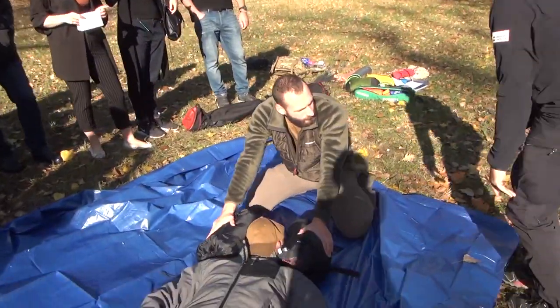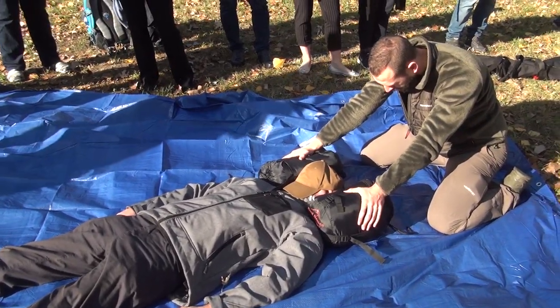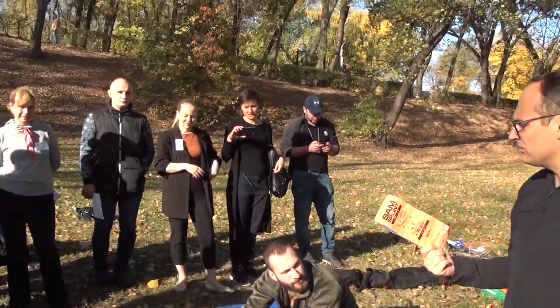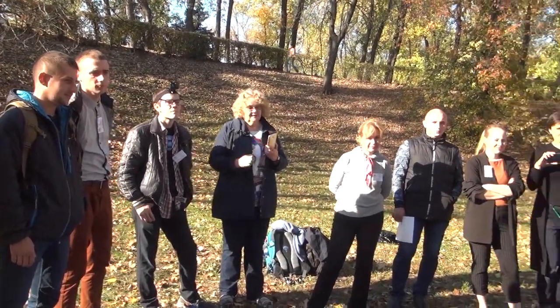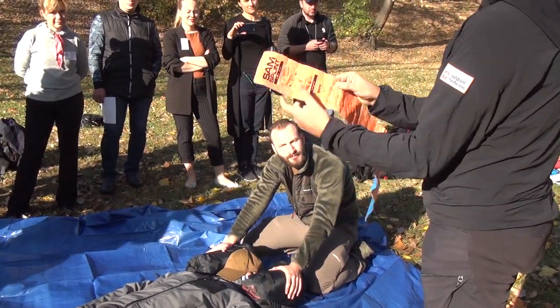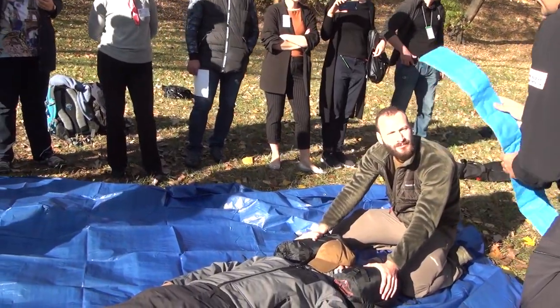Another thing you can use for the C-spine is something which some hikers would have in their pocket. It's a SAM splint. It's about 4 or 5 euros to buy, and you can use it for a lot of things. I will pass it around later. It's basically a small plate of aluminium with foam around it. Weighs nothing. You can always stuff it somewhere in your backpack.